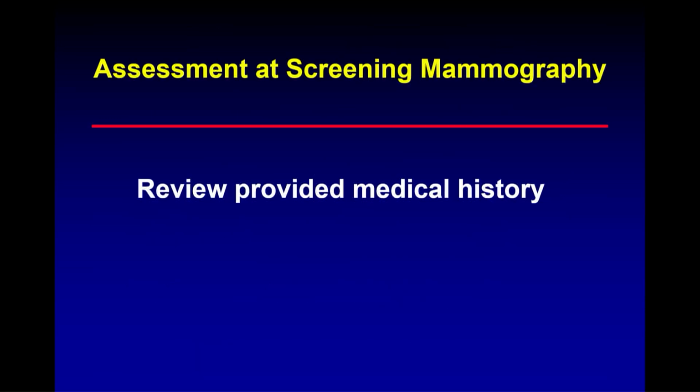Okay, so with that, we're really getting into part 2 now. There's a part 1 and a part 2. This is more the part 2 part, which is not what is asymmetry and what are its subcategories, but what do we do about them? How do we manage them?